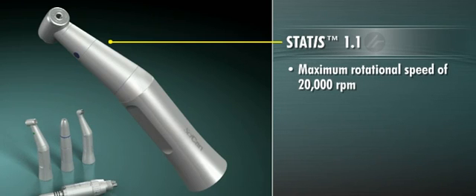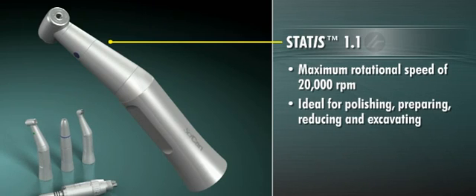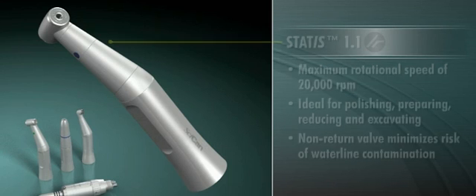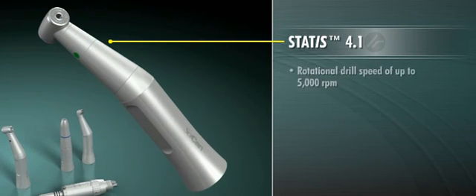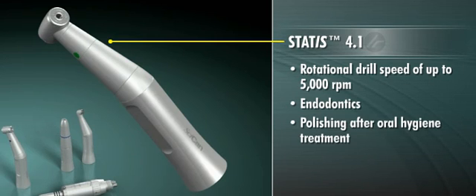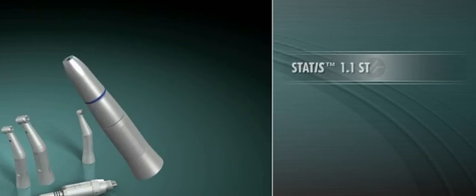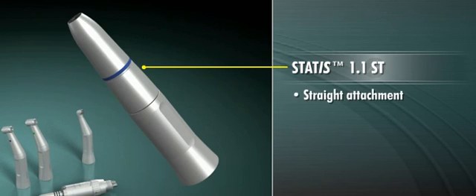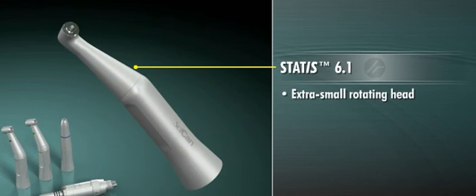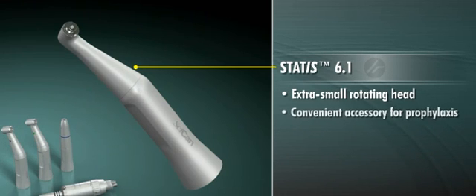The STATIS one-to-one attachment offers a maximum rotational speed of 20,000 RPM, making it ideal for polishing, preparing, reducing, and excavating, and includes a non-return valve to minimize risk of waterline contamination. The STATIS four-to-one attachment offers a rotational drill speed of up to 5,000 RPM and can be used for endodontics as well as polishing of the tooth surface after oral hygiene. The STATIS one-to-one ST is a straight attachment specifically designed for chair-side trimming and other extra-oral procedures. And the STATIS six-to-one, with its extra-small rotating head, makes a convenient accessory for prophylaxis.